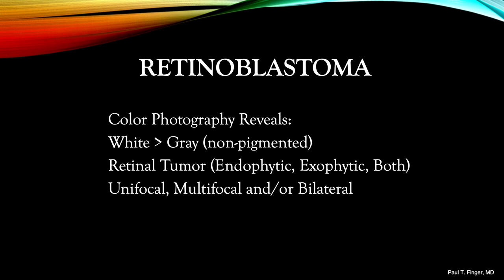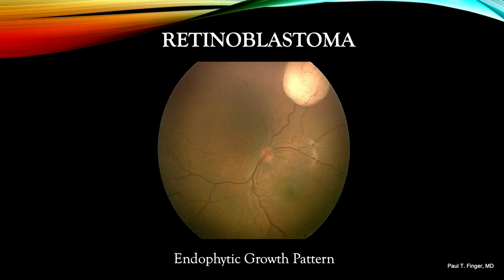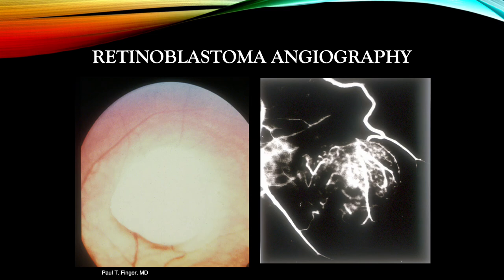In practice, we often see combinations of both. Retinoblastomas can be unifocal, multifocal, and bilateral. Here we have a color photograph of an endophytic retinoblastoma; close observation reveals both intrinsic tumor blood vessels and overlying retinal vasculature — it is an amelanotic tumor not covered by the retinal pigment epithelium. Note in the early phase fluorescein angiogram that as the tumor grew anterior to the RPE, its blood vessels are not covered, so the early phase reveals the tumor blood vessels and the overlying retinal vasculature.